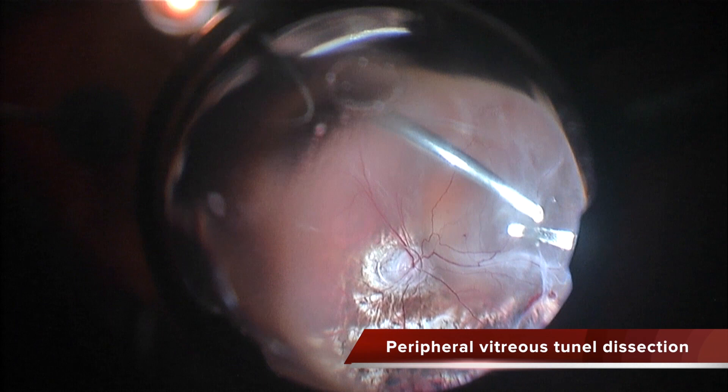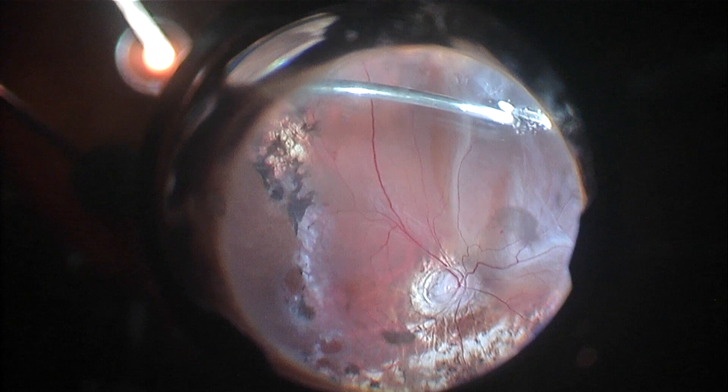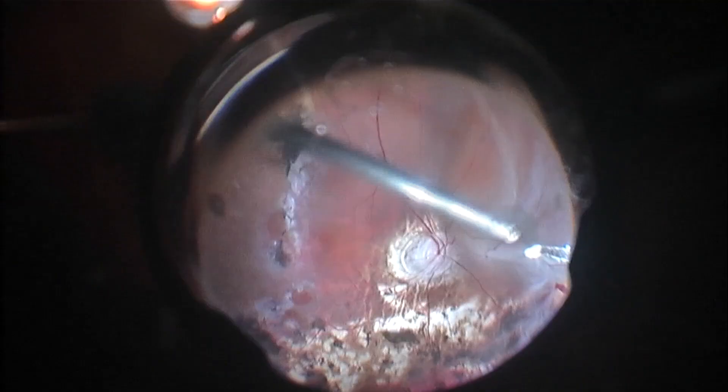After dissecting this space, I am segmenting with the illuminated pick and the cutter the insertion of the vitreous base, which is quite fibrotic. You can see how nicely I can do this.